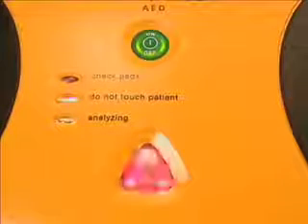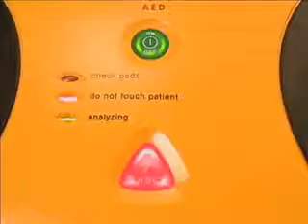Shock advised. Charging. Stand clear. If a shock is required, once the AED has fully charged, the shock button will flash and the AED will instruct you to press the shock button.